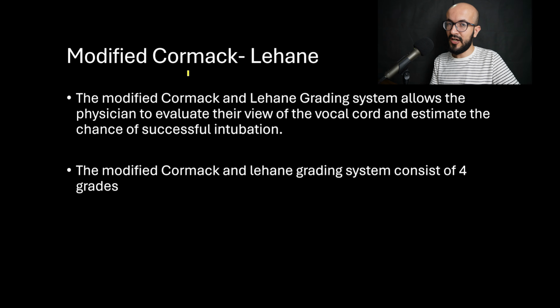Now let's talk about the modified Cormack and Lehane. The modified Cormack and Lehane grading system allows the physician to evaluate their view of the vocal cords and estimate the chance of successful intubation. The grading system consists of 4 grades.